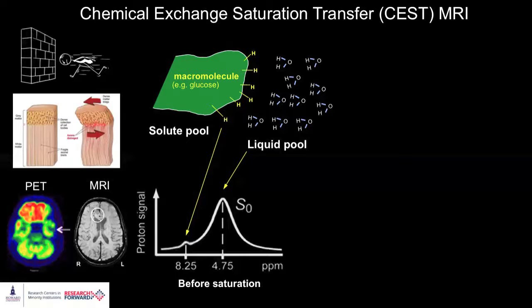disorder, happen. Lots of therapeutic studies aim to restore normal glucose metabolism, not only because it is the primary energy source of the brain, but also because it is important for the synthesis of essential brain metabolites. PET imaging is the only method for glucose measurement that can be done in vivo nowadays.